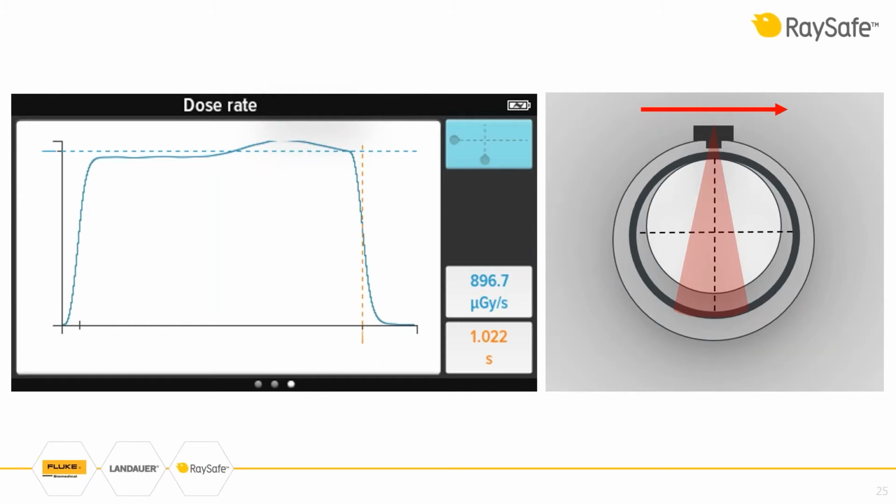So this is one of the things I often use this dose rate waveform for, both to check positioning, but also sometimes, if I'm sloppy with my notes and I go back and look at exposures I have done earlier and I'm not sure, for example, as we will see later, if I did a measurement in a phantom or not, you can use this dose rate waveform to check your assumptions that exposure number 5 was really what it was in your notes, or if you forgot to write your notes.